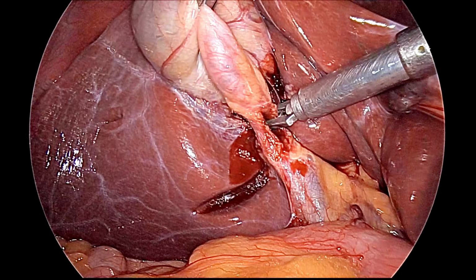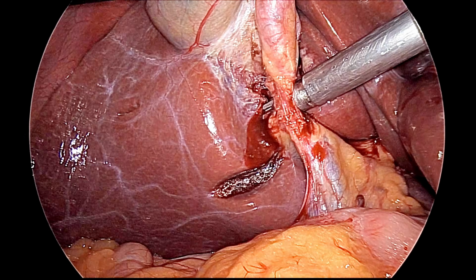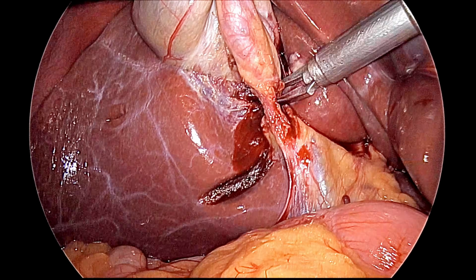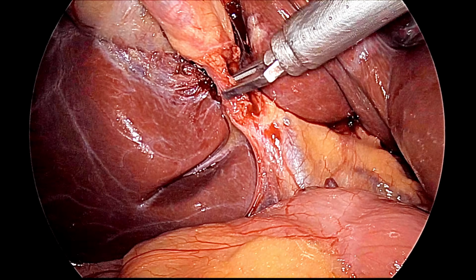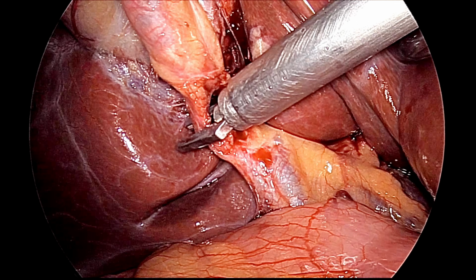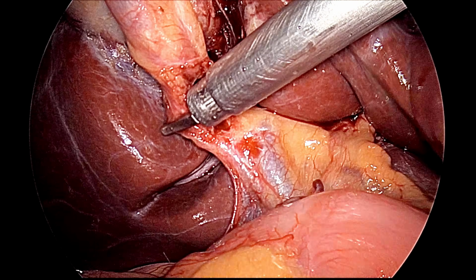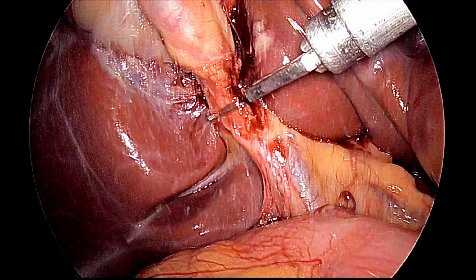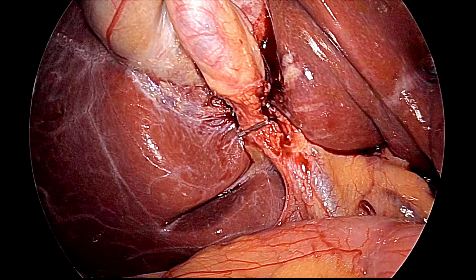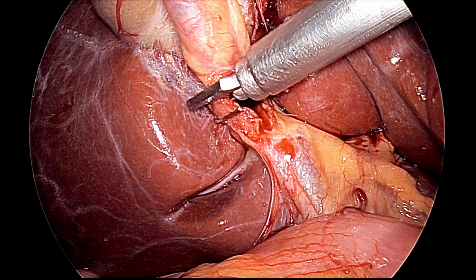After that, we are clipping the artery, and both limbs of the clip applicator must be visible, because we are using harmonic. So, one clip on the artery is enough, and after that you can clip the duct. So, the first clip will be towards the CBD, but it should not do lateral clipping of the CBD. So, remain at least 3 millimeter away from the CBD, and after that we will apply the third clip.